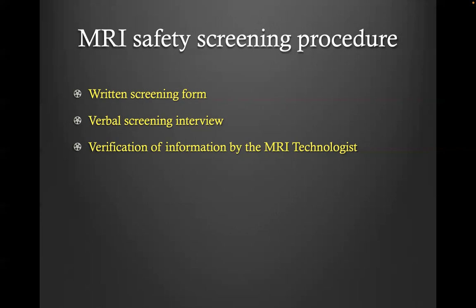We have been asked why they need to do the MI checklist, since we are going to go through it anyway. But the reason is that you want to screen them ahead of time and catch any problem way ahead of time. And then we can work out solutions before you bring the person to us, which would be a waste of your energy and our time as well as scanner time.